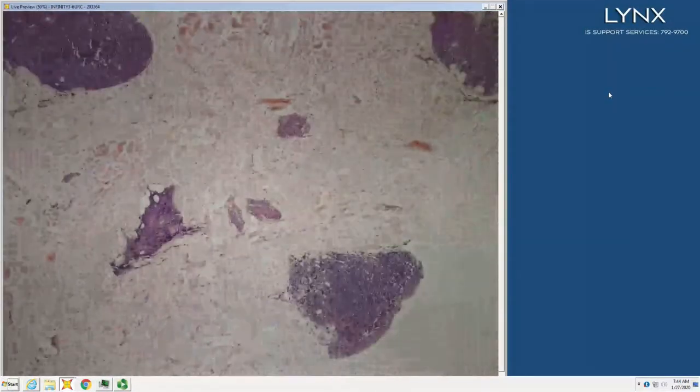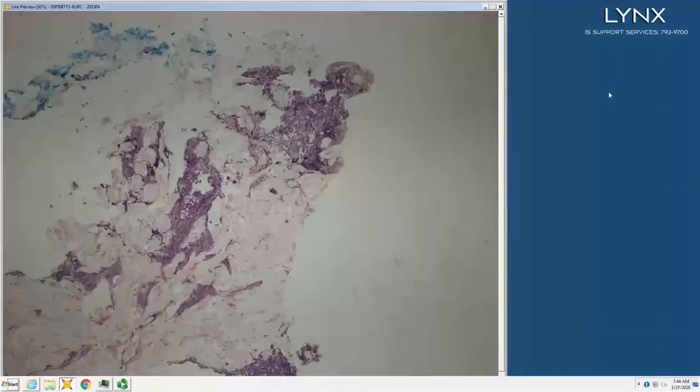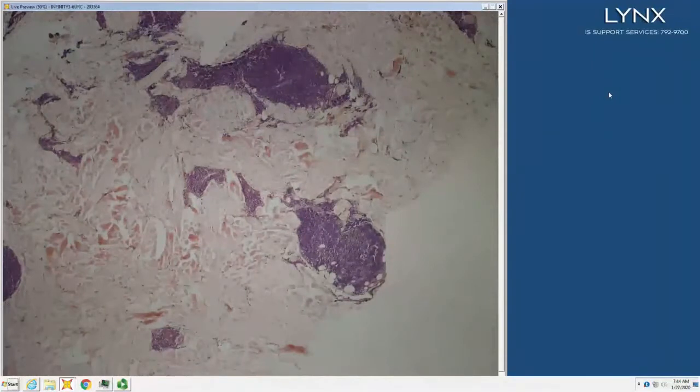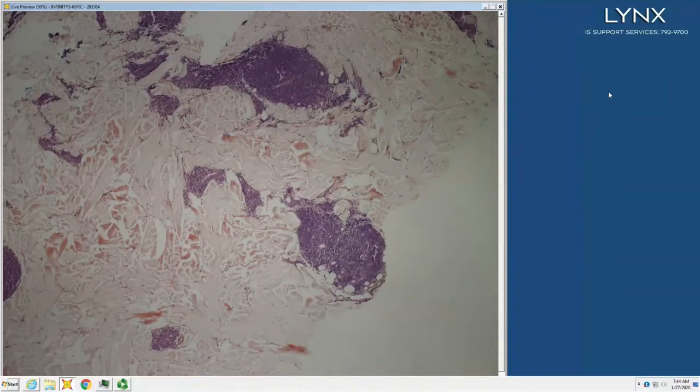Again, you got something very patchy. So there could be a couple of things. If this is a Mohs case and you have dense lymphoid infiltrates that just won't go away, they just stay on forever, one of the possibilities is your patient has CLL. Vic Marks, great Mohs surgeon at Geisinger, would about twice a year pick up the phone and call the internist and say, "Are you aware your patient has CLL?"